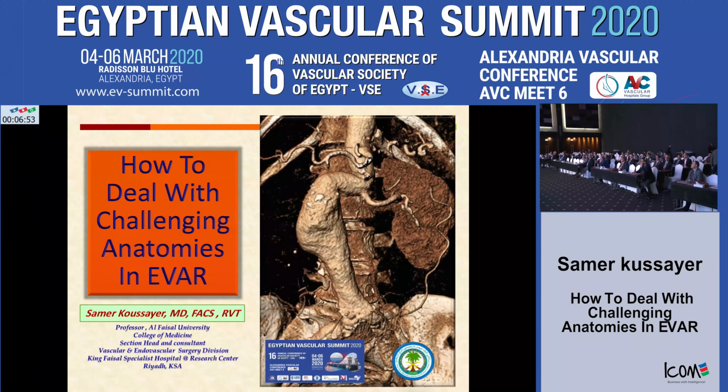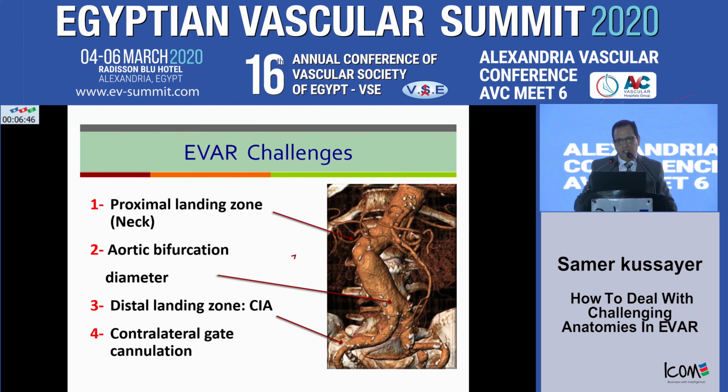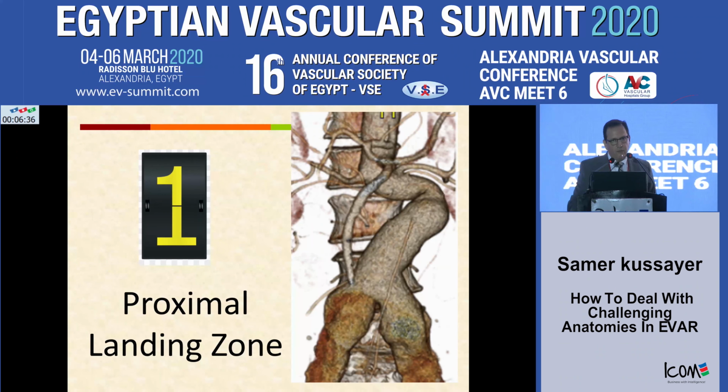I'm going to give you some tips and tricks on how we deal with difficult, challenging anatomy during EVAR. When we do the EVAR, the challenge could be at the proximal landing zone, at the aortic bifurcation, at the distal landing zone, or in the contralateral gate cannulation. So I'm going to go through each one. Let's start first with the proximal landing zone.